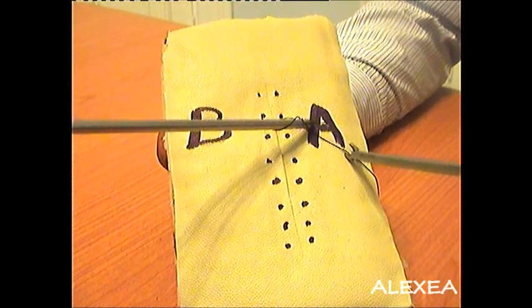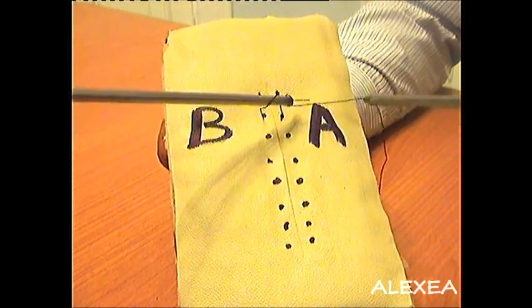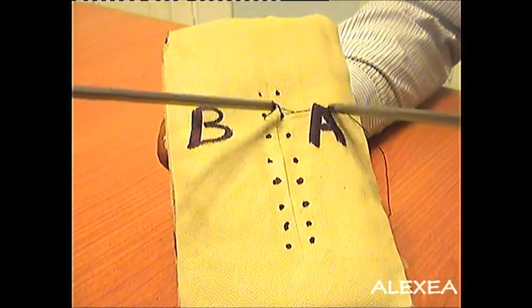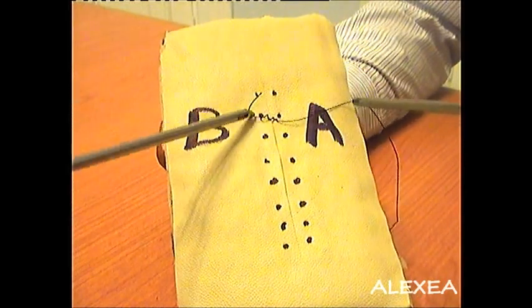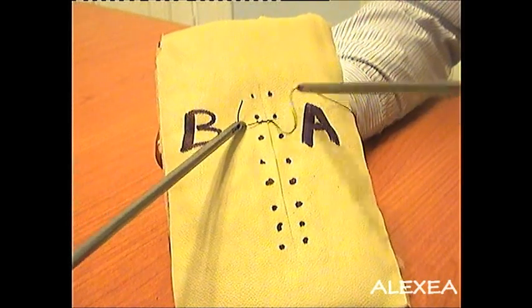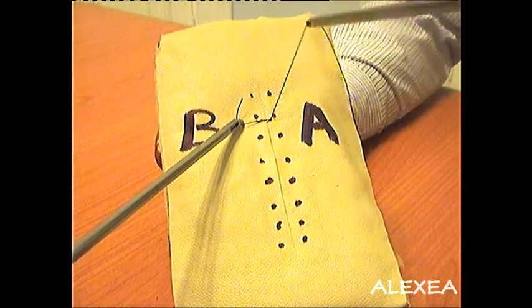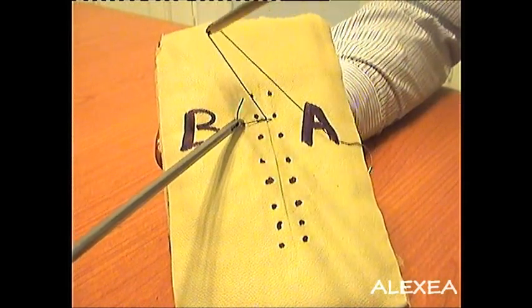Leave the needle and release the knot towards side A. Pull side A but never side B. The short end must be kept stable. Knot number 1 is taken.